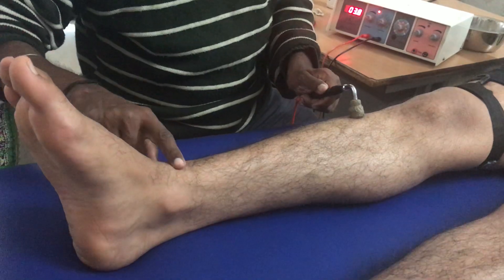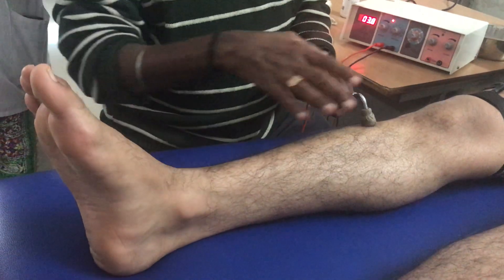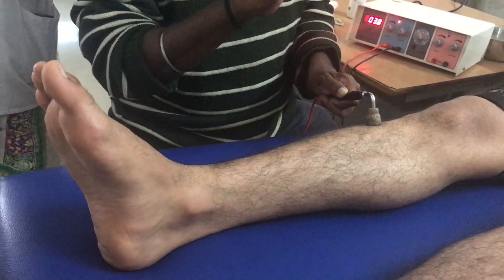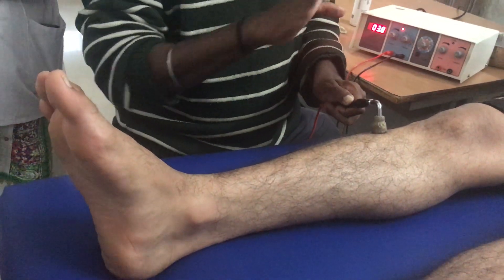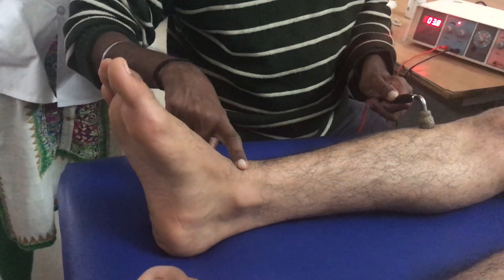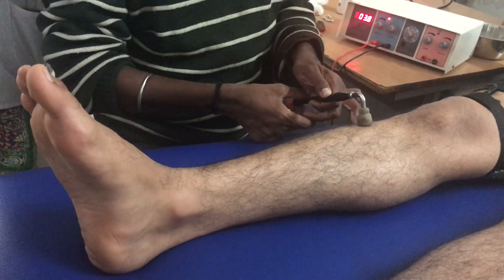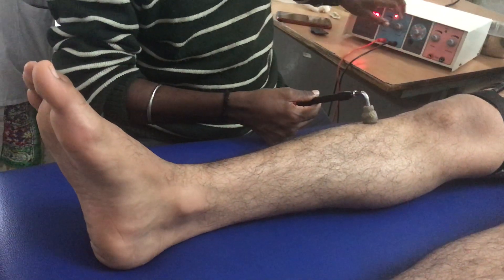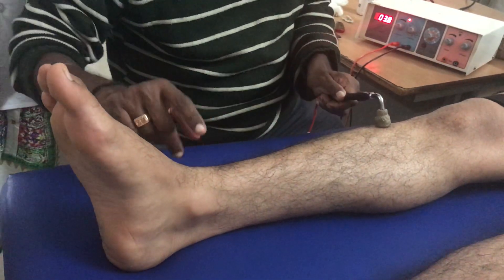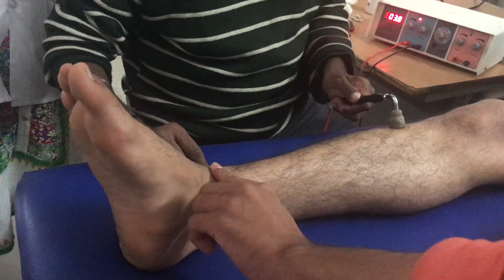Many times you cannot allow the muscle to get stimulated too long, because if it is denervated, the muscle would have gotten fatigued. That is why it should take less than three minutes to finish. I do not want the muscle to go into fatigue, especially in a denervated case. Now I am going for the next duration, which is 100ms. I am going to palpate the strength again.